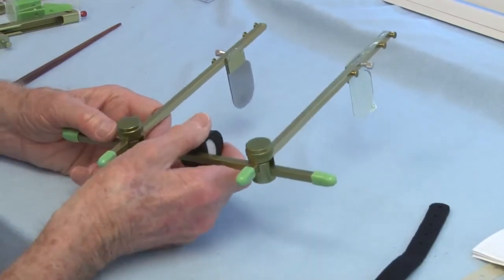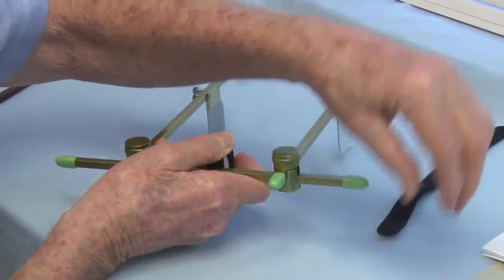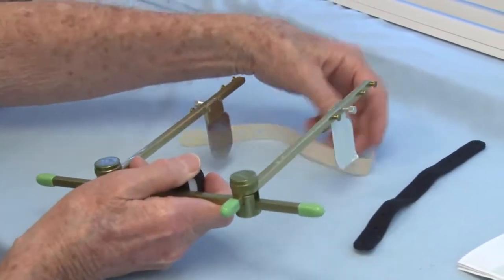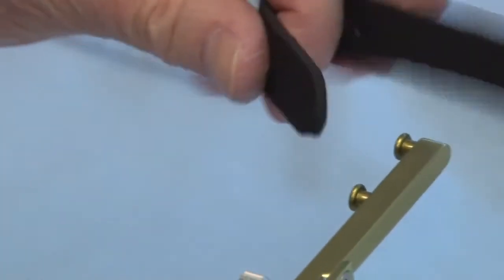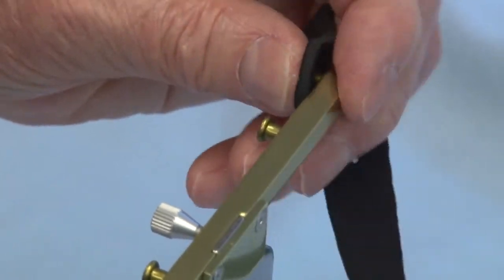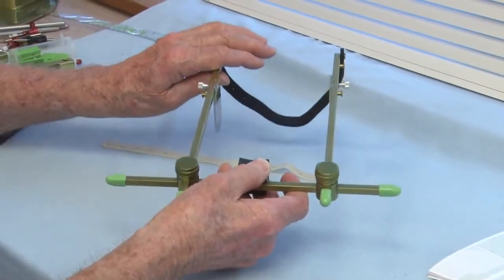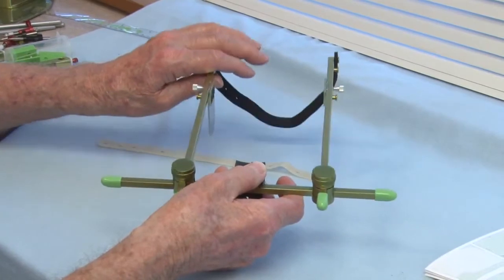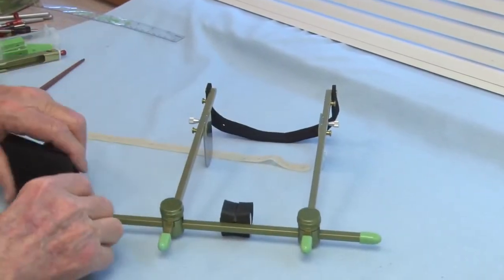and now then you support this on the patient by using a rubber band, either one of these rubber bands, and you hook the rubber band on the post here, and it goes over to this side, and that goes around the patient's back of the head and supports the anterior posterior position of the flag assembly. You want to support the vertical position of the flag assembly, and so you use these Velcro straps to do that.